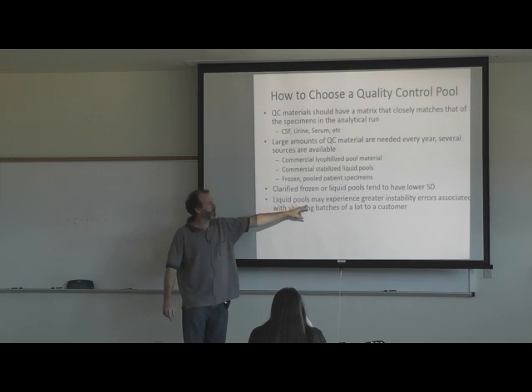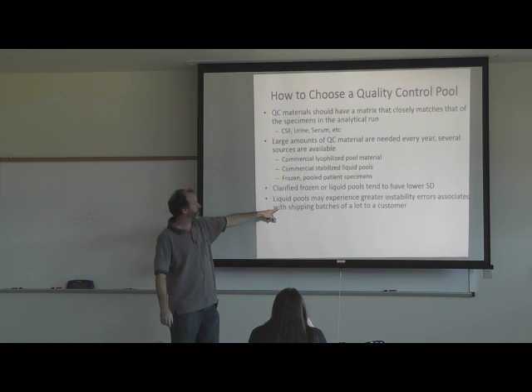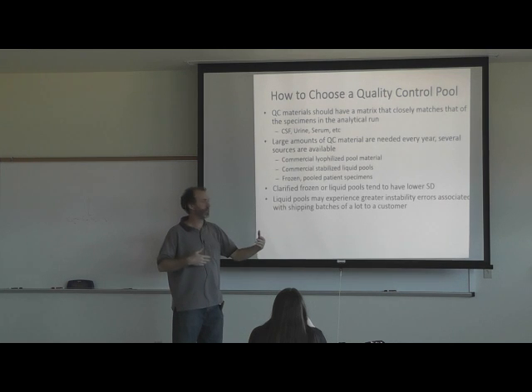Liquid pools may experience greater instability errors associated with shipping batches of a lot to a customer because they're stabilized liquid.